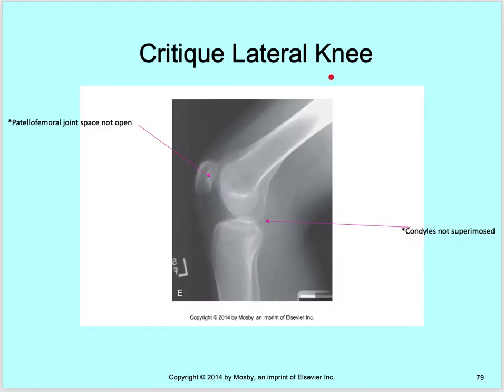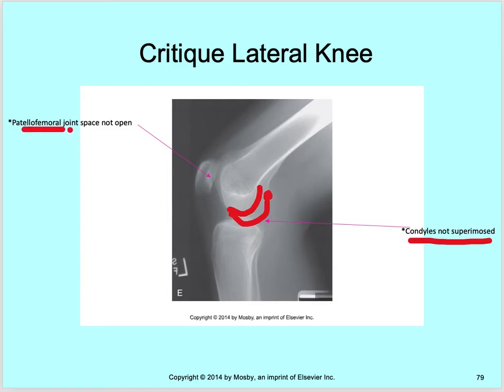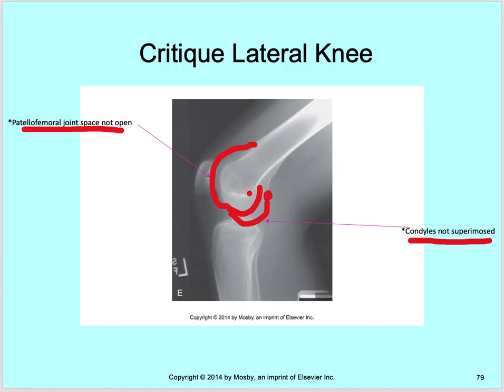Critiquing a lateral knee: the condyles are not superimposed — you're seeing one condyle here and another here. And more than likely this is the adductor tubercle. The patellar-femoral joint space is not open. The way this is rotated, you can see your lateral condyle, and it's closing that joint space. This means the patient is rotated towards the IR and needs to be rotated away. That knee needs to come up a little bit so those condyles are superimposed over one another to open up the joint spaces.